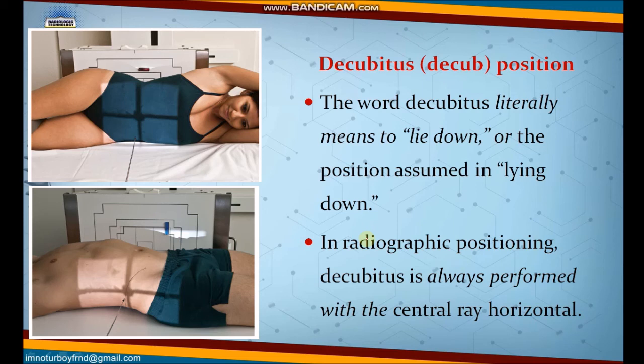For example, here we have the radiography of the torso. You have the abdomen AP, and then lateral abdominal projection. So the projection remains the same, named by entrance and exit. For example, this one enters the anterior, exits the posterior, so the central ray projection remains the same: anteroposterior. There, it enters the lateral, exits the lateral, basically a lateral projection.